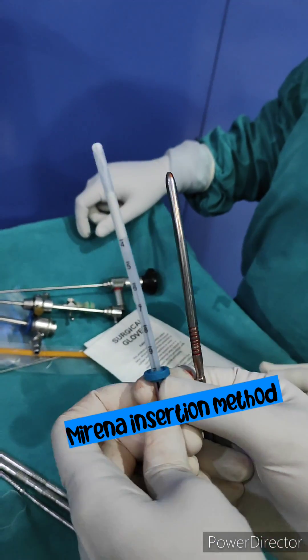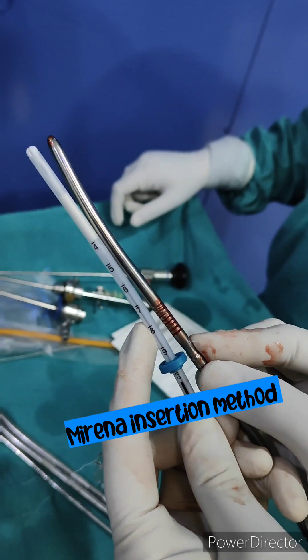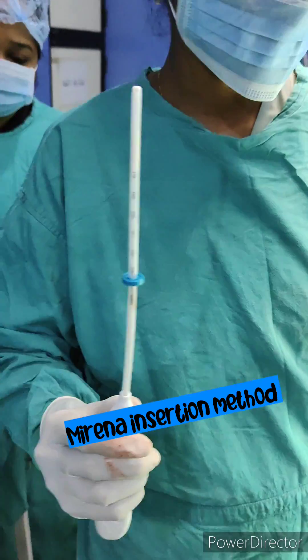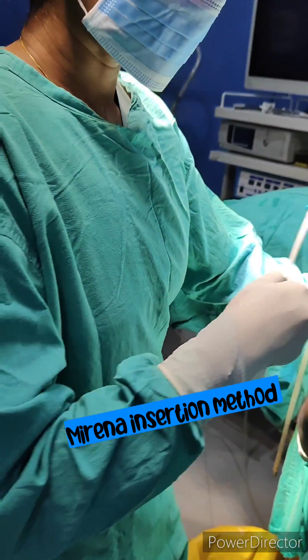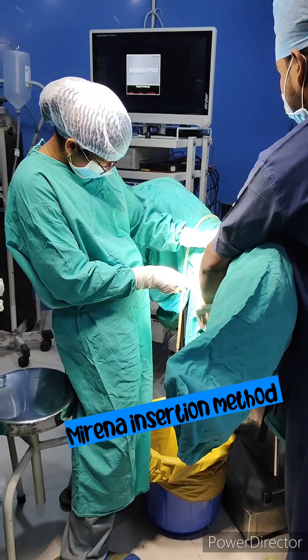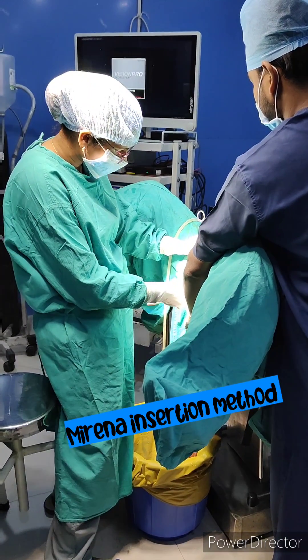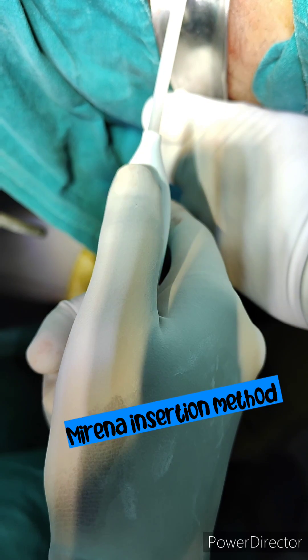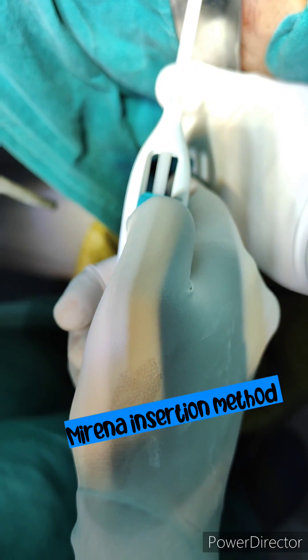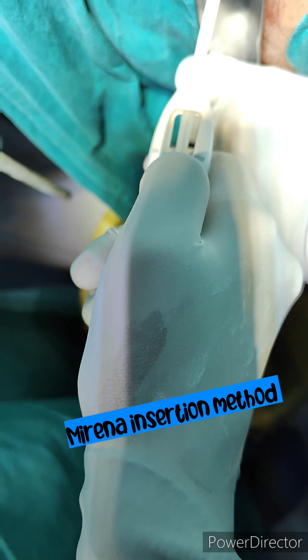After setting the flange, you insert the whole thing into the cervix and uterus. The flange should be out at 2 to 3 cm from the cervix. After that, you release the Mirena by taking the slider till the mark and wait for 20 to 30 seconds.